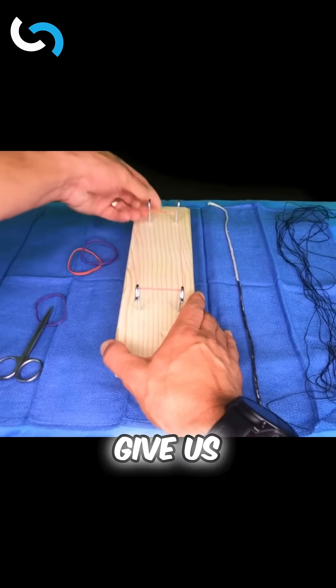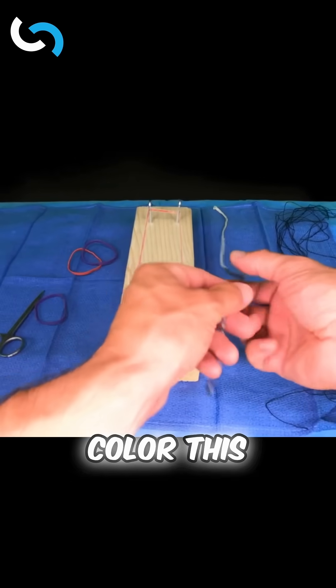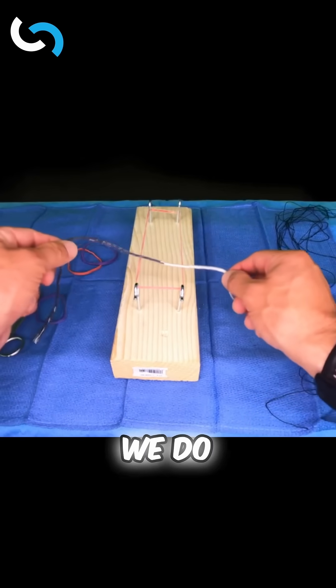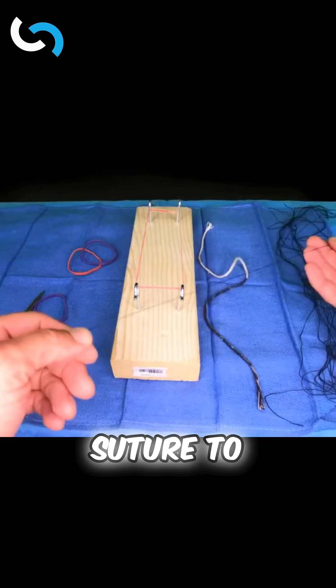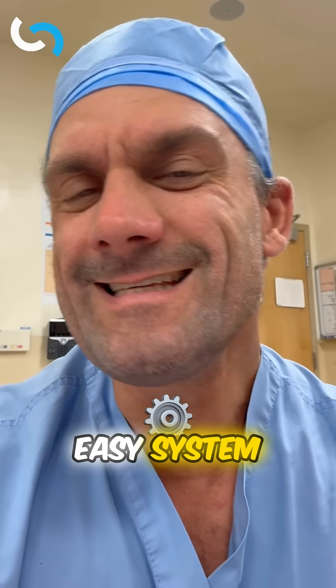We get one of these industrial rubber bands, put them around the hooks, and that gives us some nice tension. I picked up a colored string to help you tell left from right — that's what we do when we're beginning. When we get more advanced, we can use actual suture to practice those knots.